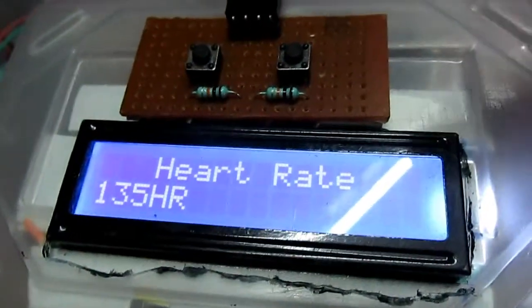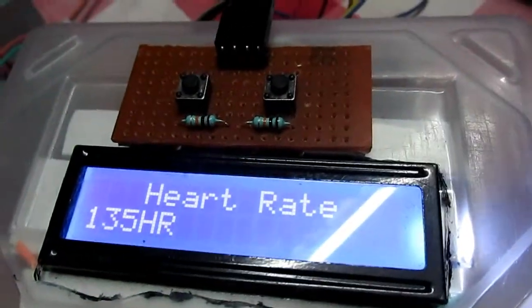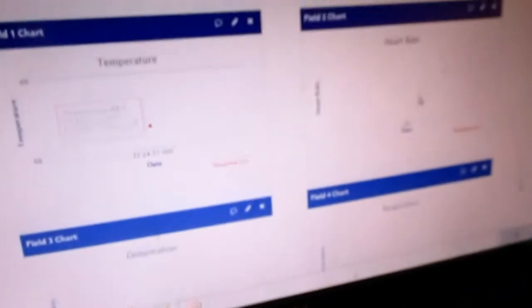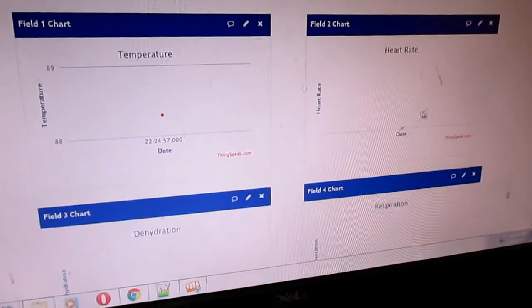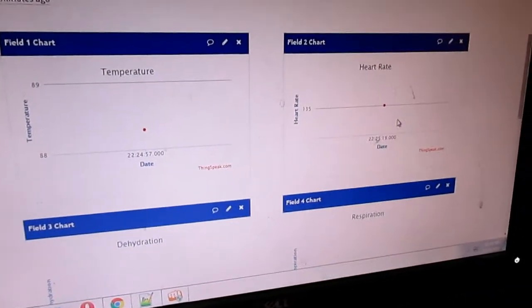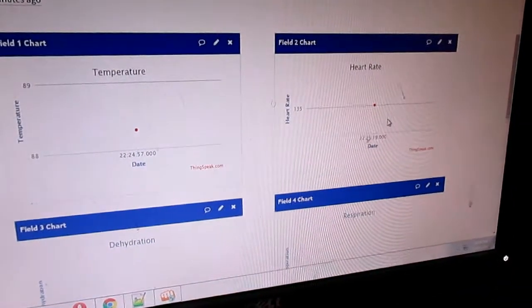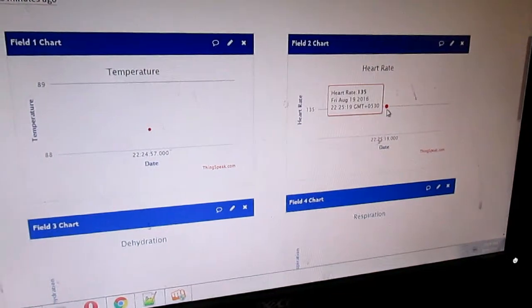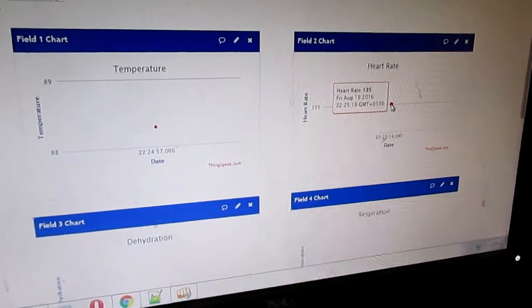Now the heart rate is 135. So this is the heart rate reading of 135.